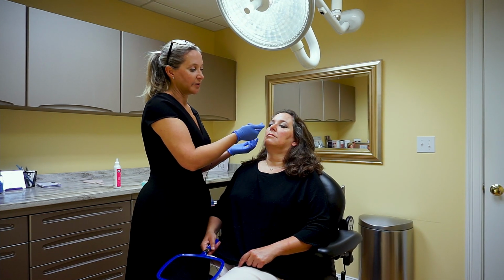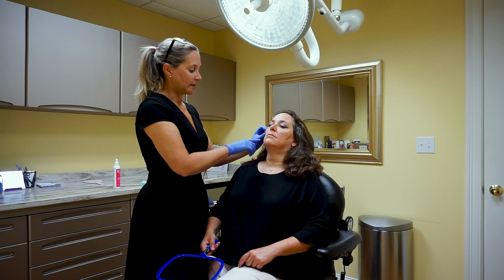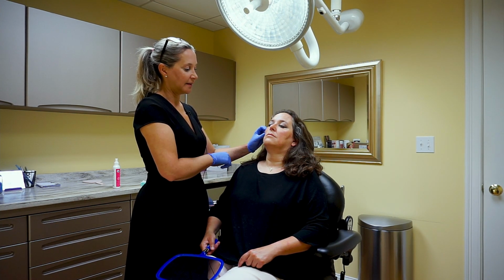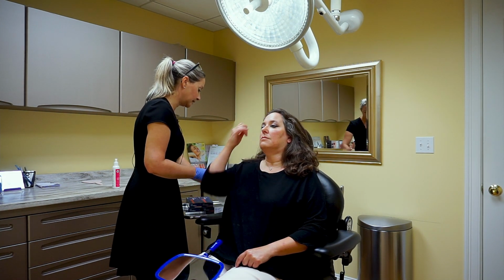If she had hollow under her eyes, we could restore that, and then that will give a little lift to the little bit of jowling she has, and then I'll come back and fill in the nasolabial folds. I'm not going to do anything to her jawline because it's fine.